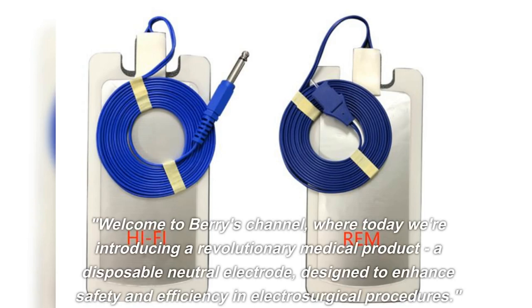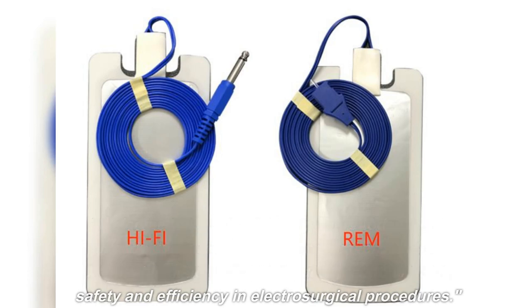Welcome to Barry's channel where today we're introducing a revolutionary medical product: a disposable neutral electrode designed to enhance safety and efficiency in electrosurgical procedures.